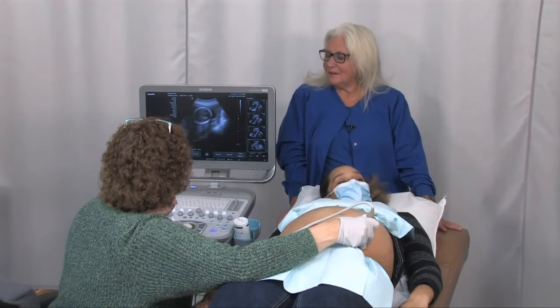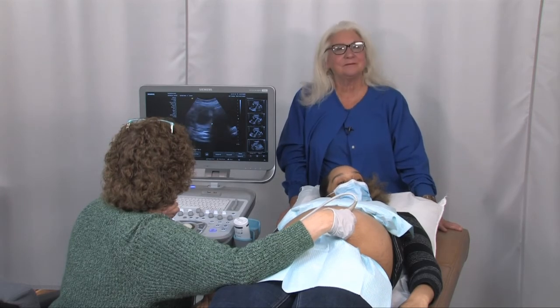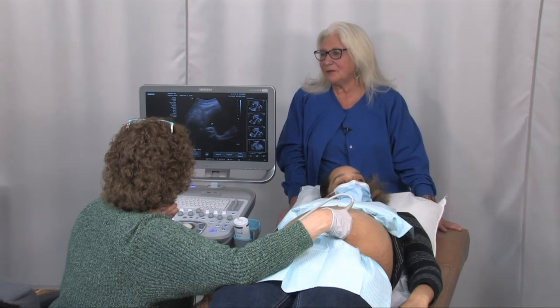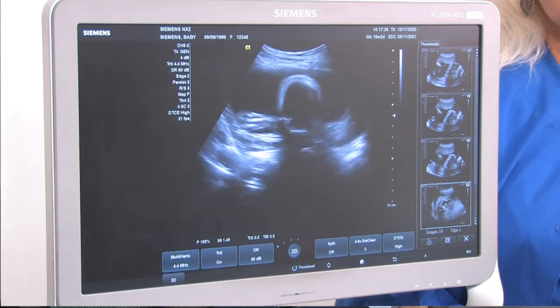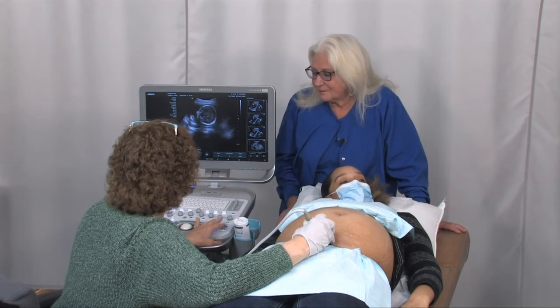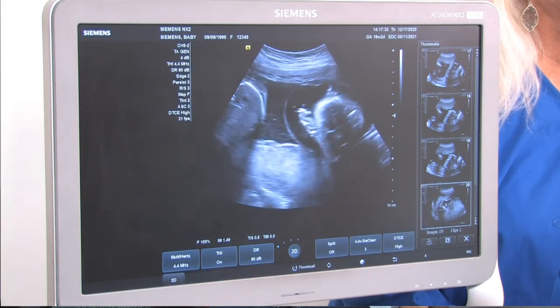Hey, while I'm thinking of it, can you demonstrate how to do a cine movie? A movie, capturing an actual movie? Yeah, you just hit the clip store. Let me turn off my little thing. We'll start down transverse, and I'm going to hit clip store, and it is now recording. I have it set for 120 seconds, but you can set it for 3 seconds.